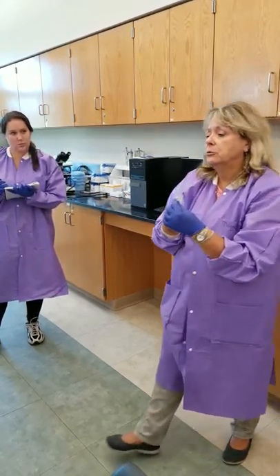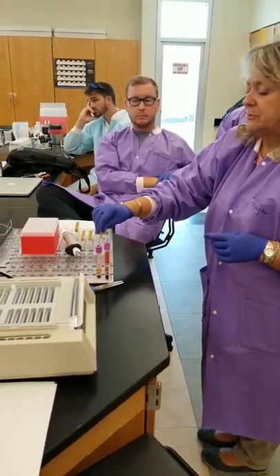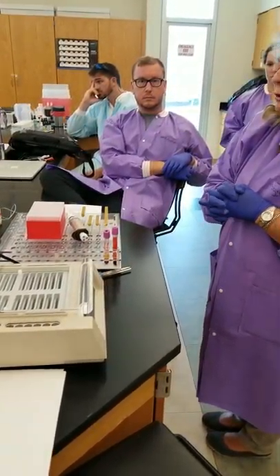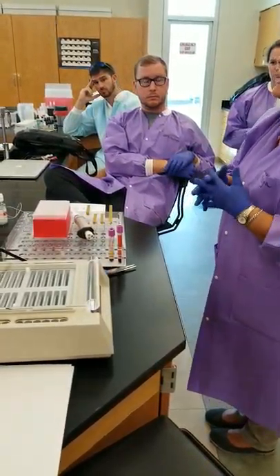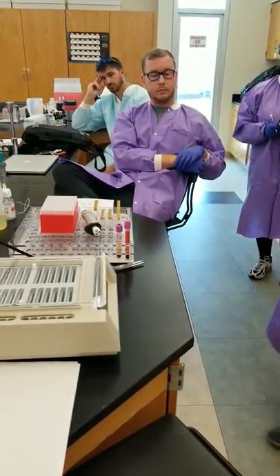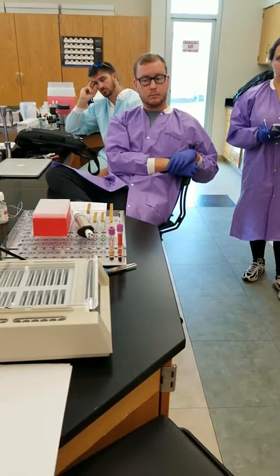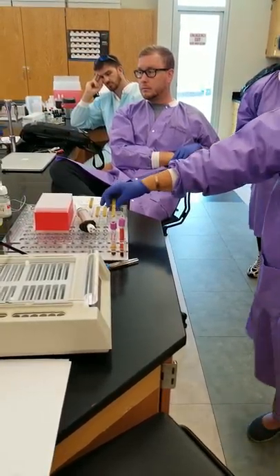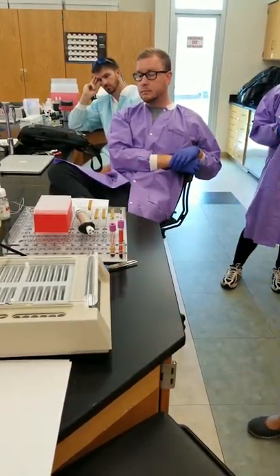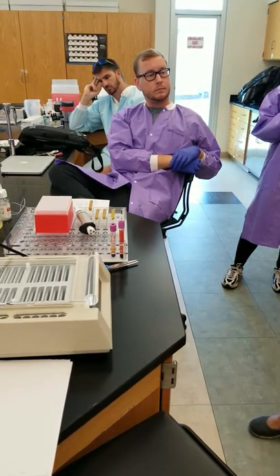So it's pretty cool. They will tell you that it's much more streamlined as far as being able to standardize when you use gel as opposed to tubes. If you do a positive screen and you want somebody to see it, it's very hard to preserve that positive screen and let somebody else look at it later. Whereas with these, there's a foil coating at the top. You can slop a piece of tape over the top of it and it'll preserve until it starts to evaporate.